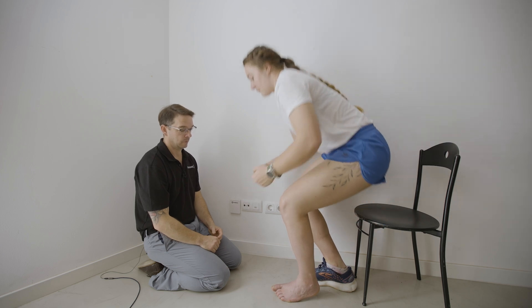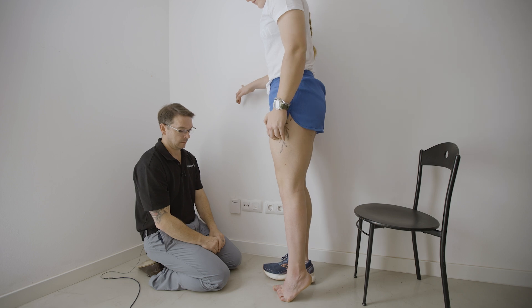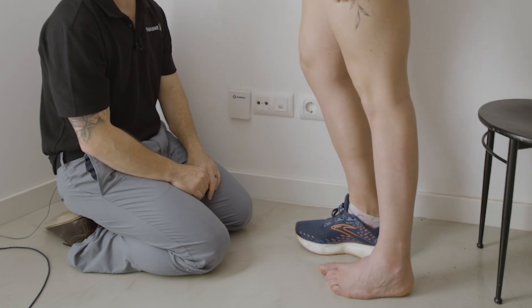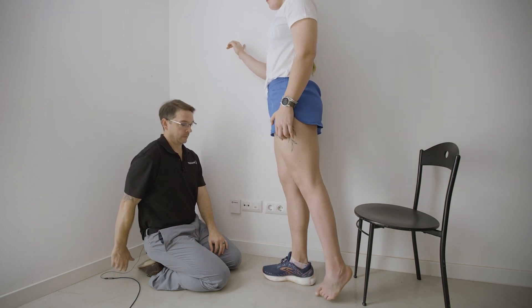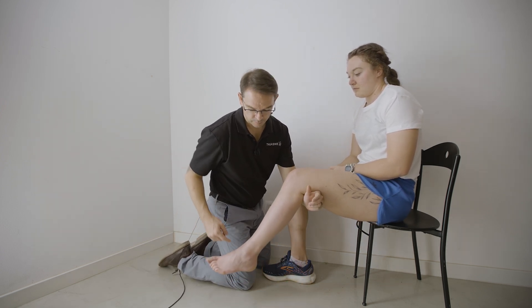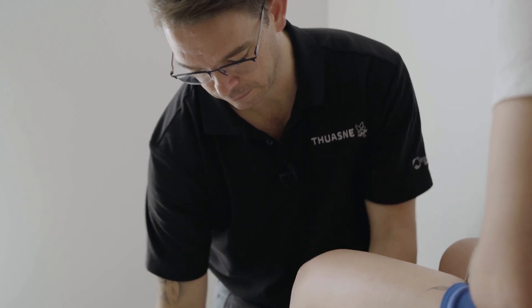Just to finish off your muscle power assessment — could you please stand for me? Are you able to do a heel lift? How many of those can you do in a row? From that position, are you able to keep your leg straight and push your leg back? Thank you, please take a seat. And the last one is your hamstring — can you please pull your heel towards the chair? Resist me. That's very strong. Alright, we are now ready to cast.